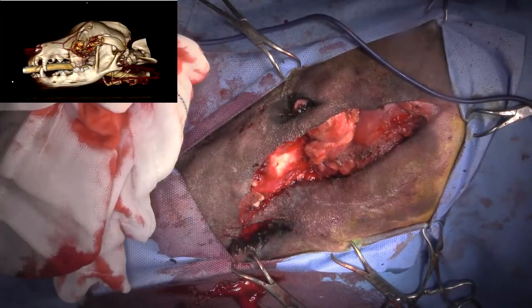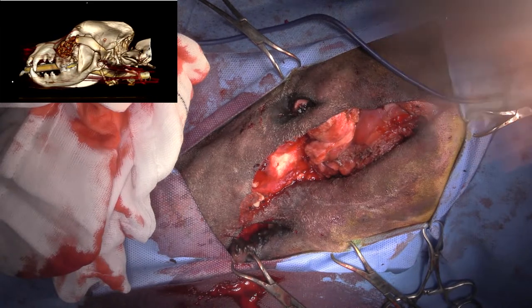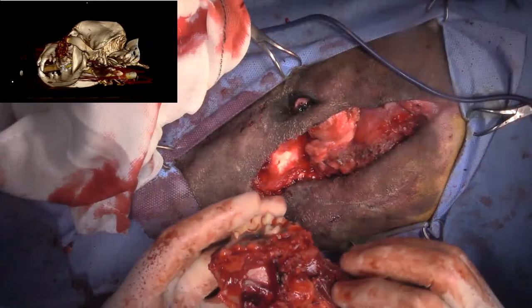Unfortunately, that wire collet was labeled incorrectly. That was a pin collet. Just let you guys have a look again at what we've got here.